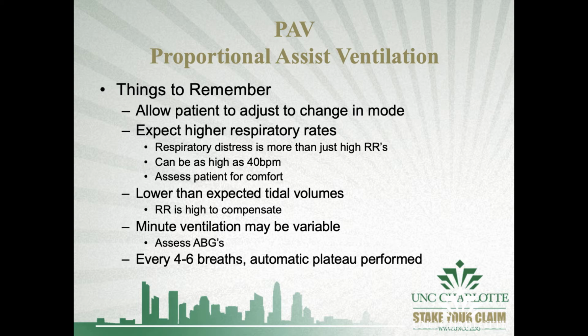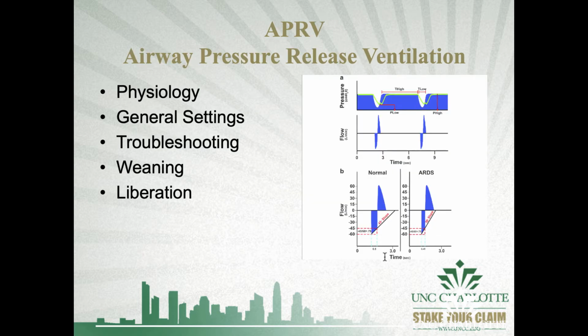I think clearly in this slide, to me, this doesn't make any sense. It sounds like a failed SBT in my opinion. But there is some research out there that says that it works a little better in certain patient populations. But just so you know, this is a mode of ventilation that might be available to you. You might have a physician request this. So you have this background knowledge, do a little bit of digging around on your own, and understand what goals we're trying to achieve with PAV.